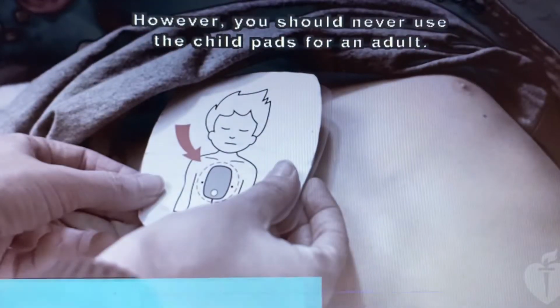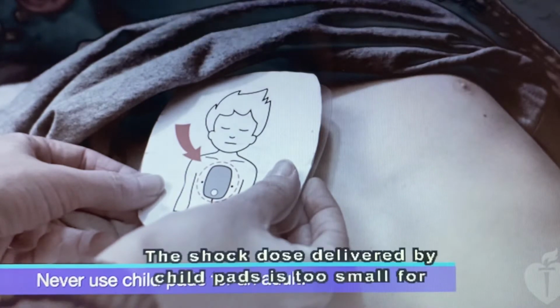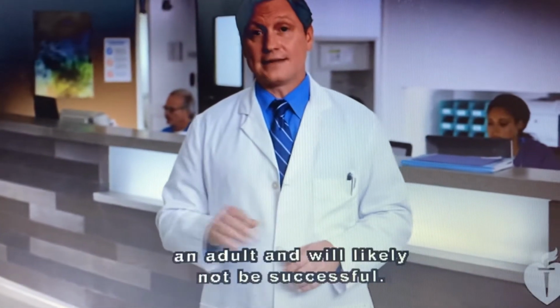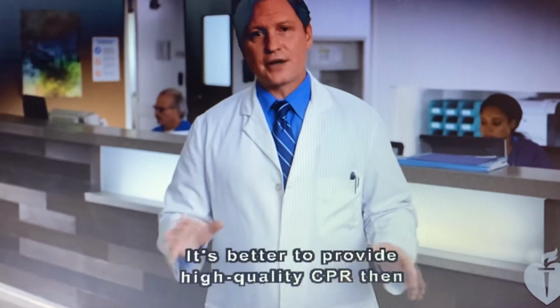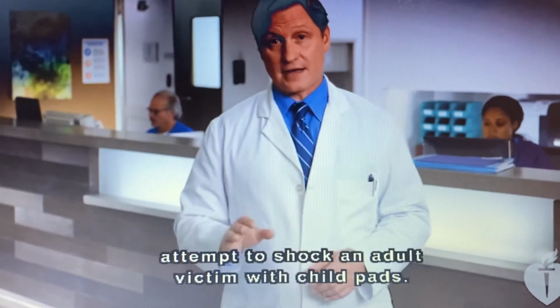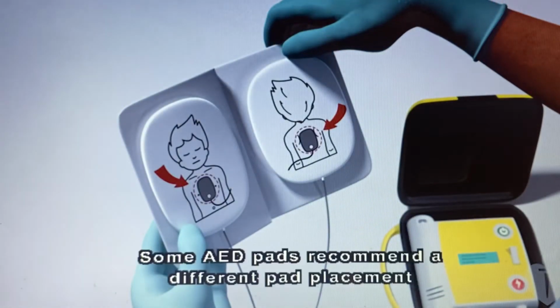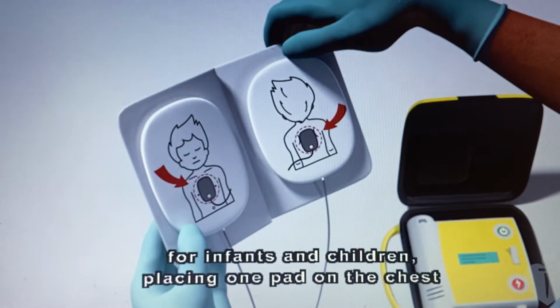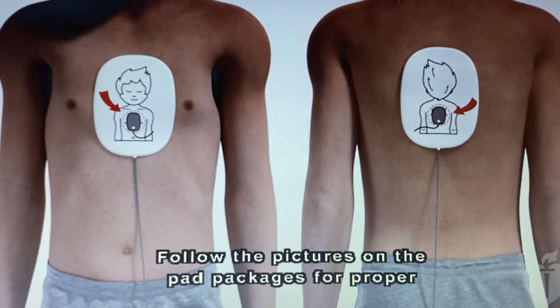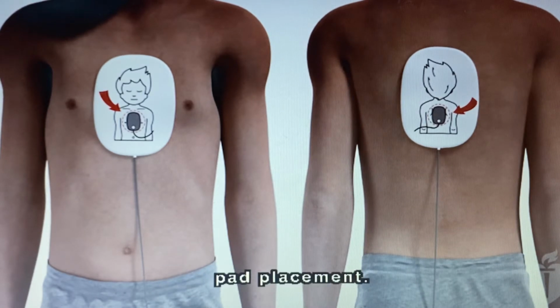However, you should never use the child pads for an adult. The shock dose delivered by child pads is too small for an adult and will likely not be successful. It's better to provide high-quality CPR than attempt to shock an adult victim with child pads. Some AED pads recommend a different pad placement for infants and children, placing one pad on the chest and one pad on the back. Follow the pictures on the pad packages for proper pad placement.